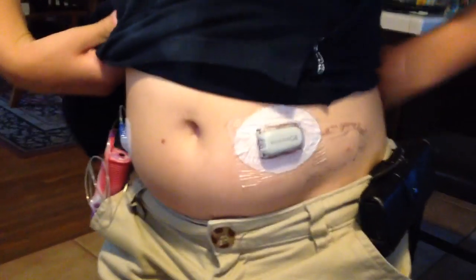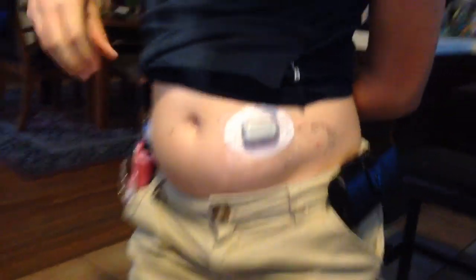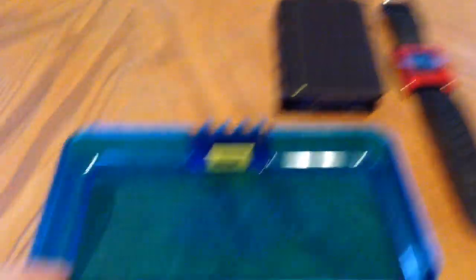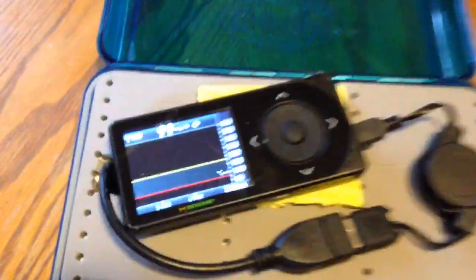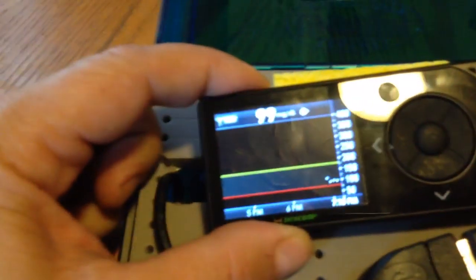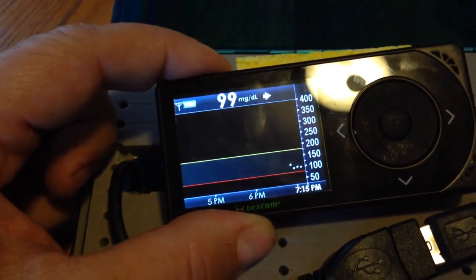You have to have the Dexcom CGM sensor, which is right there. We just put a brand new one in tonight, so it just came online. Now what we have is her Dexcom CGM receiver here that just came online not too long ago, currently showing that her blood sugar is 99.